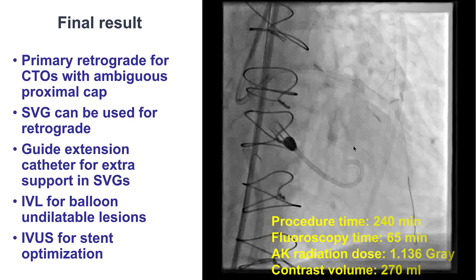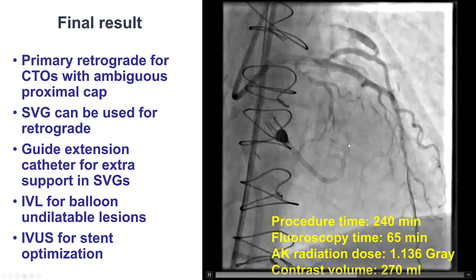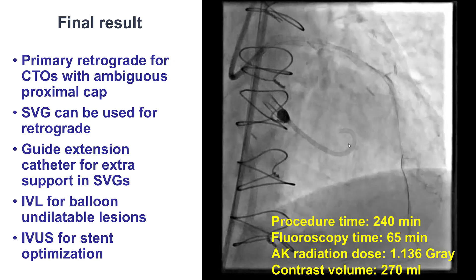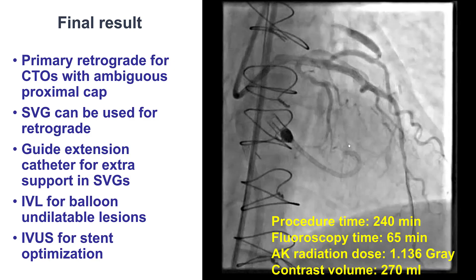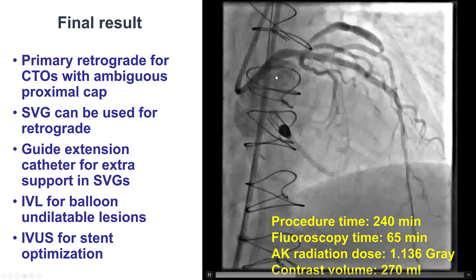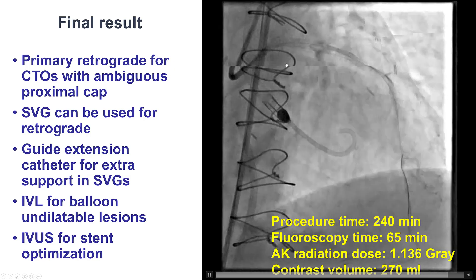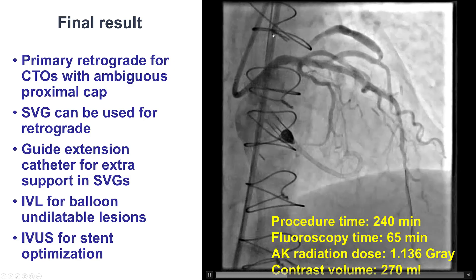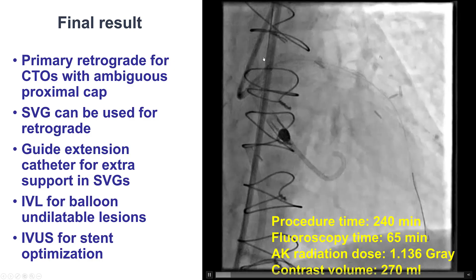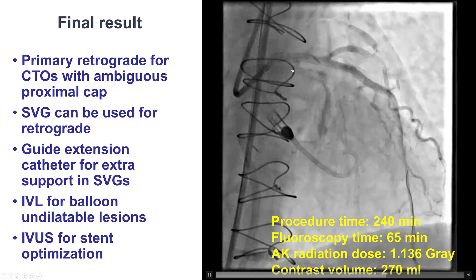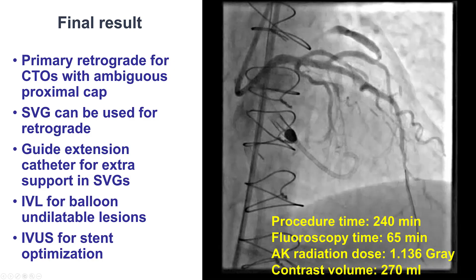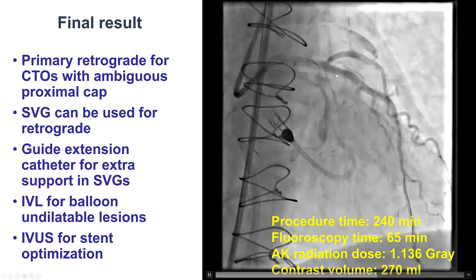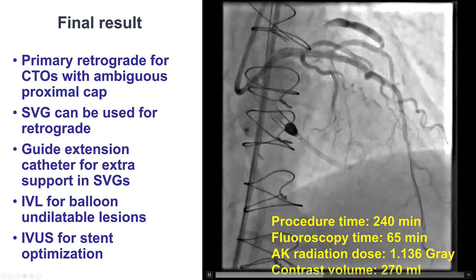This was the final result with good backflow and excellent flow into the LAD, as well as the Ramus and the circumflex. Multiple lessons from this case: vein grafts can be a very efficient and safe way to perform retrograde crossing of CTOs; a primary retrograde approach is indicated in patients with ambiguous proximal cap. Support can be poor when performing PCI through vein grafts, and using a guide extension upfront can help increase support and facilitate crossing. Intravascular lithotripsy can be very useful for calcified lesions, and use of intravascular imaging is critical to ensure good stent expansion. Thank you.